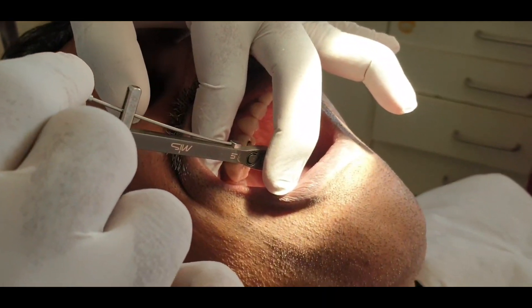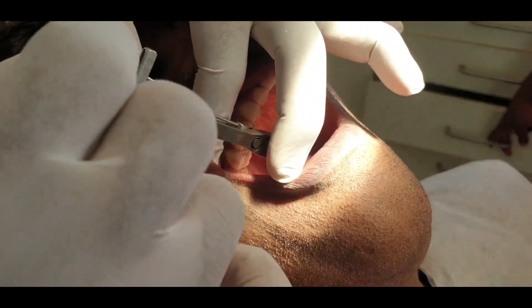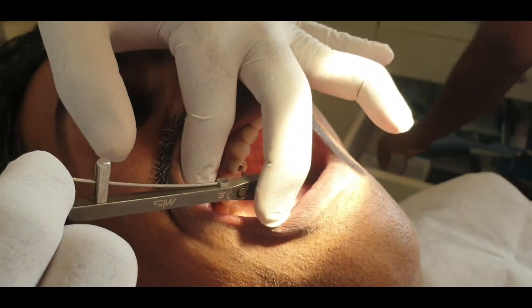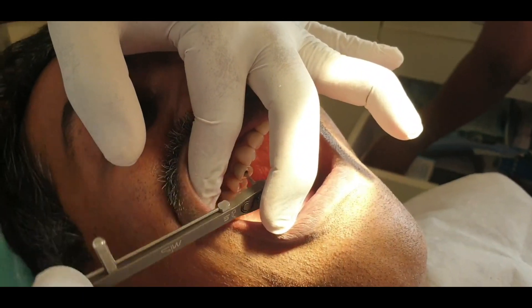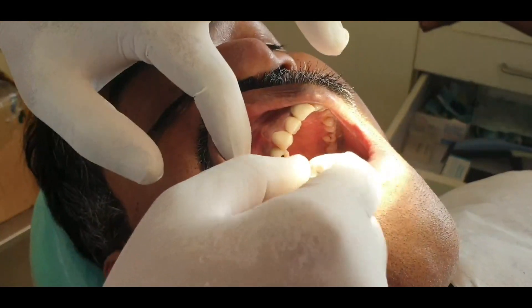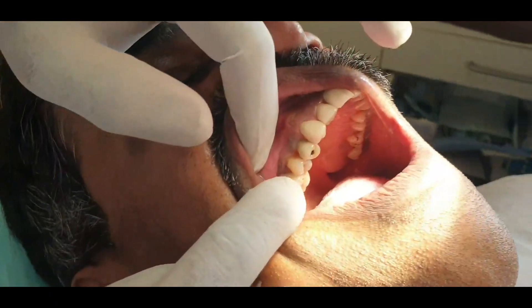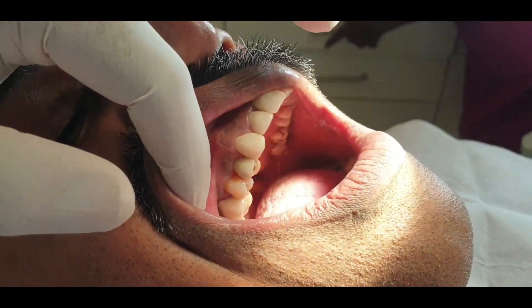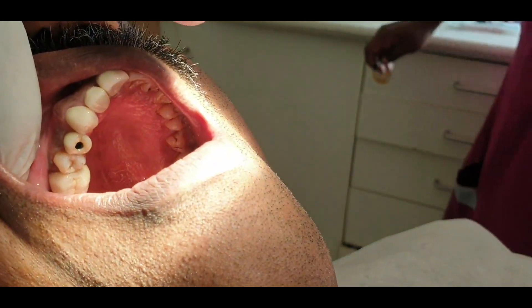I believe in torquing up to 20N. If we use 20N, we are going to be tight and can unscrew it. We have to do a small space. This is the implant crown, and this is a natural crown. This is the screw access hole.